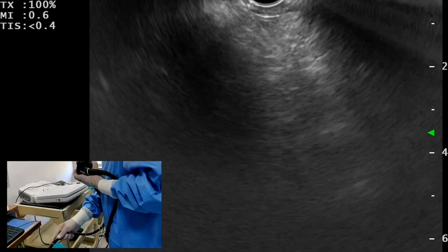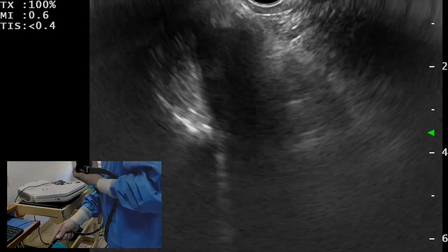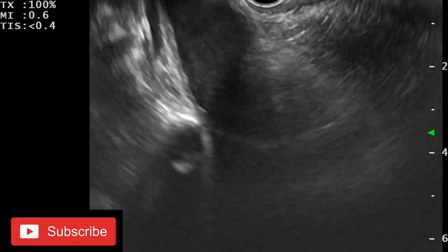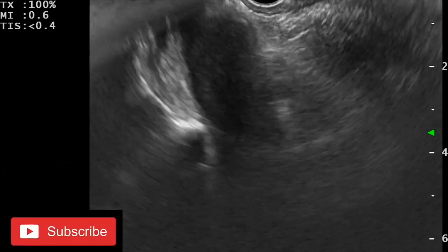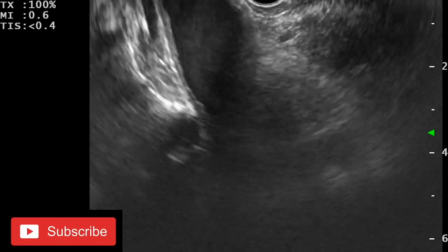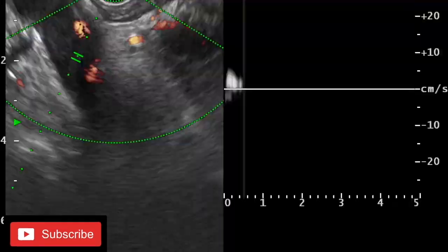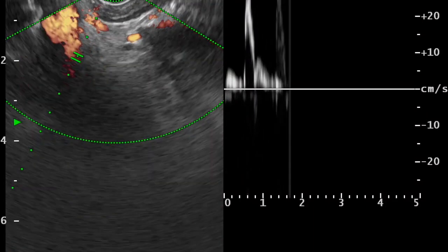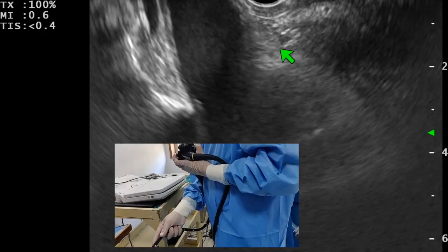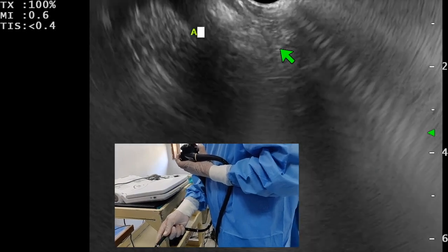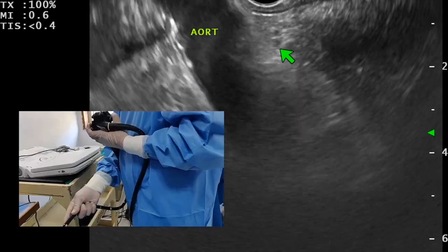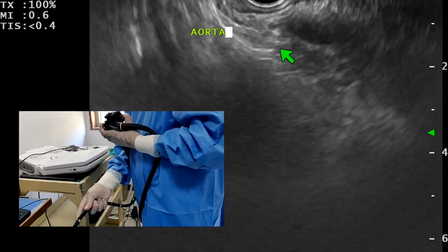From this position, if we again give a clockwise torque, we can see another large vessel which is the abdominal aorta. So from the kidney, by clockwise torque, first we can see the inferior vena cava, then the abdominal aorta. If we apply Doppler we can see arterial flow.